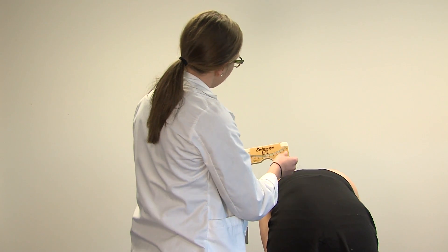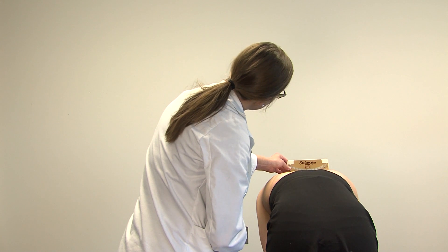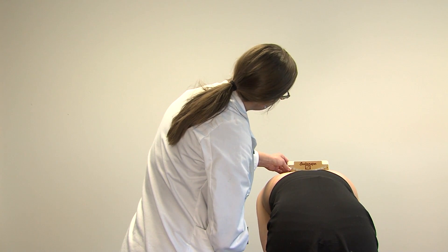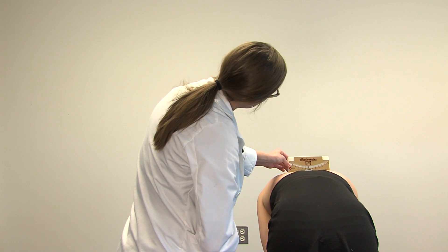Standing behind the patient, have the patient bend forward until the thoracic spine is parallel to the ground. Place the scoliometer level at T1 and slowly advance in a caudal direction. Take note of where the needle moves.